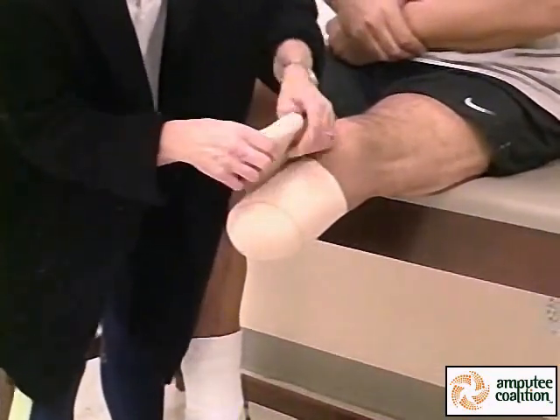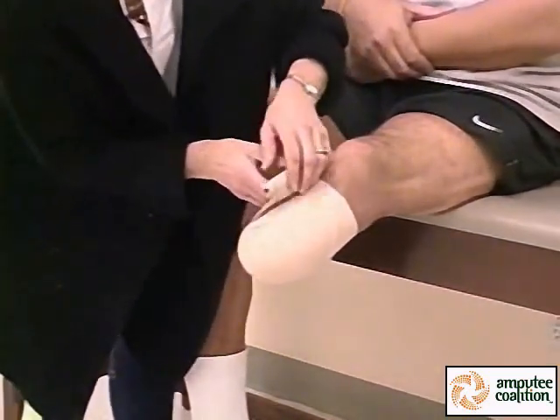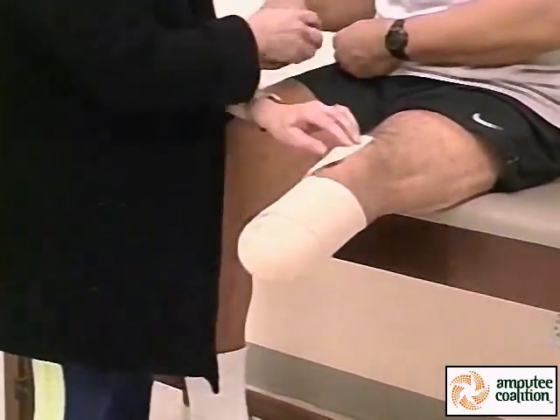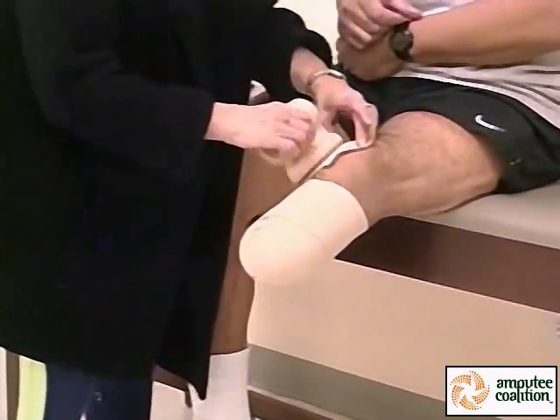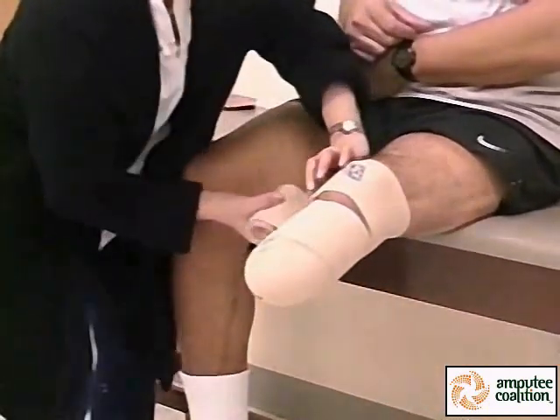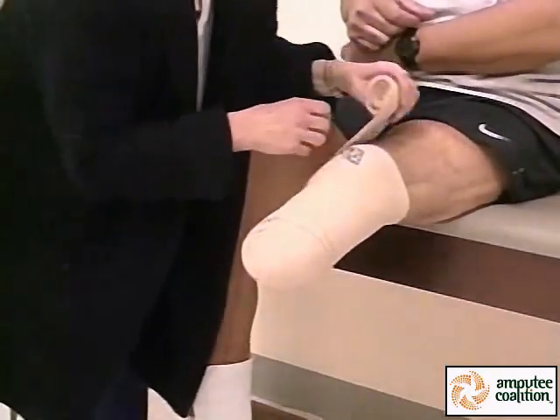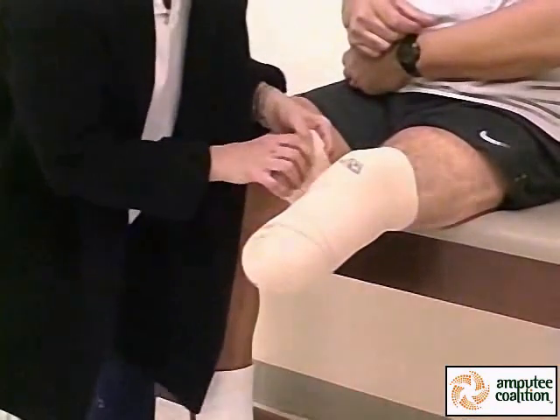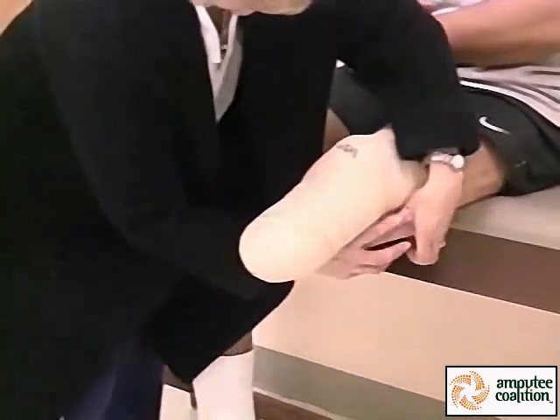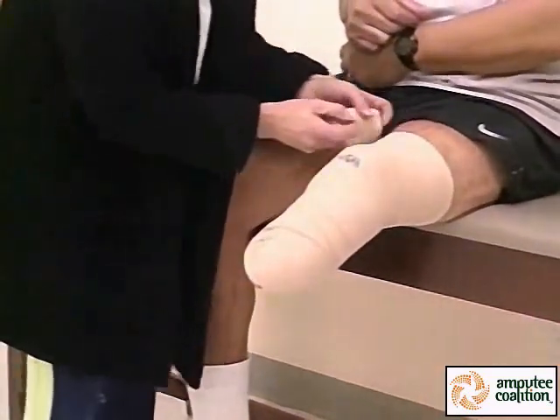Then continue up the leg with less stretch to the knee and secure. Or, if the limb is short, take a second bandage, cover the knee, then go below and above in another figure-of-eight pattern, and then secure with tape.